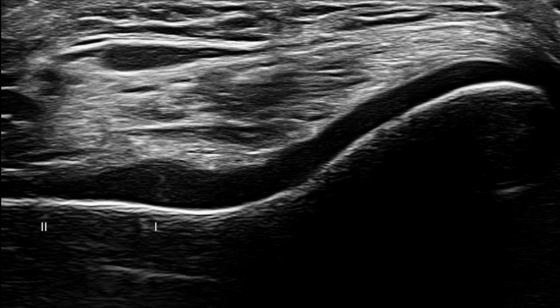In this transverse view of the trochlear groove, focal areas of grade 1 and grade 2 chondromalacia are visible. Grade 1 represents cartilage softening, seen as mild thickening and slightly increased echogenicity. Grade 2 is characterized by partial thickness loss that does not exceed 50% of normal cartilage thickness.